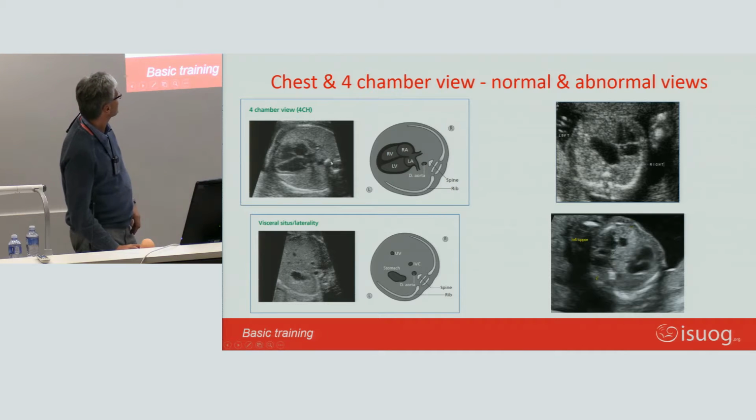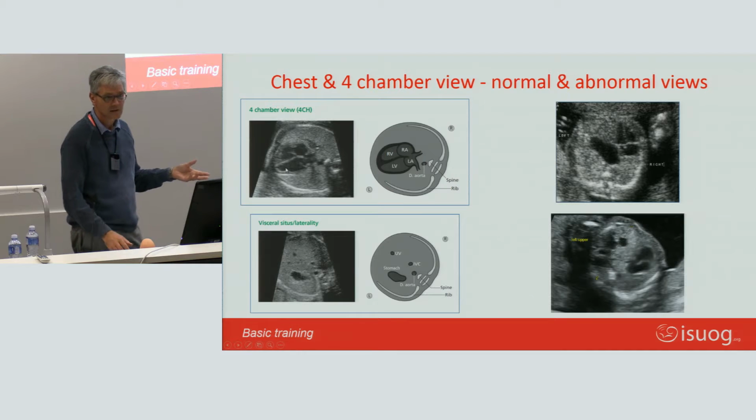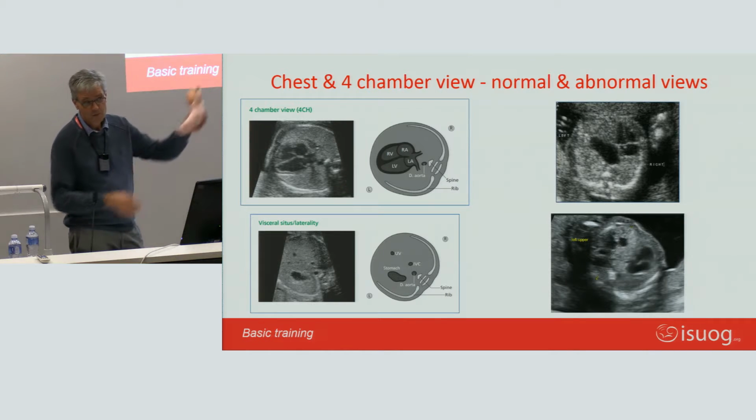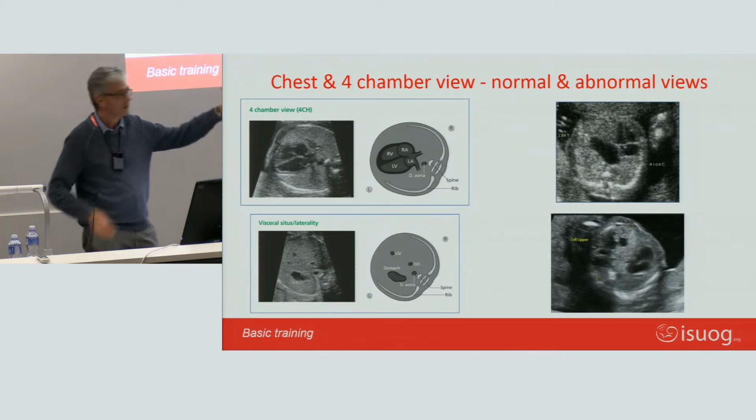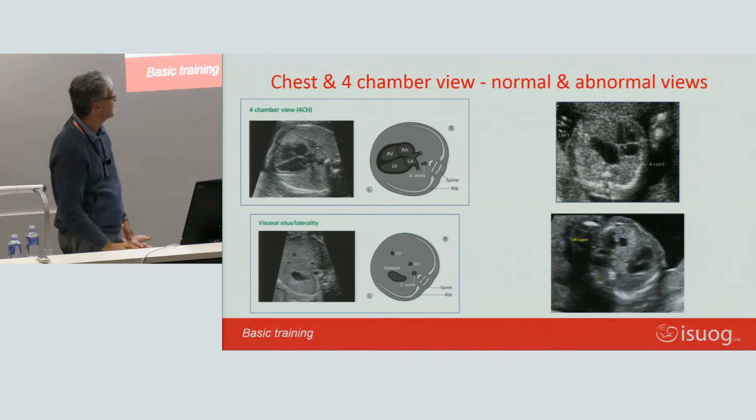There we go. So the heart is 1/3 of the chest. It points to the left. How do you know what's left? You ask Poppy, how are you lying? Which is your left hand? That's left, that's where the heart should be pointing.